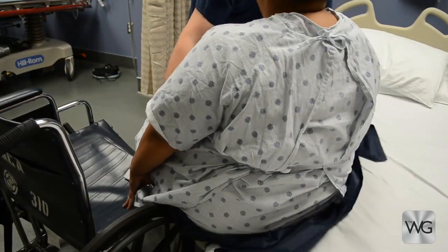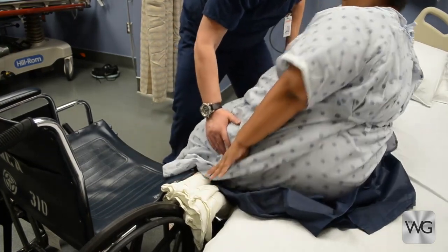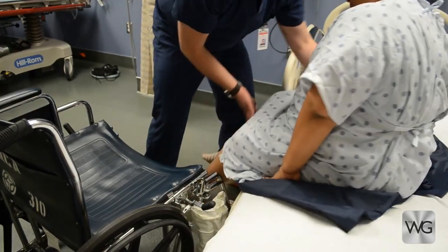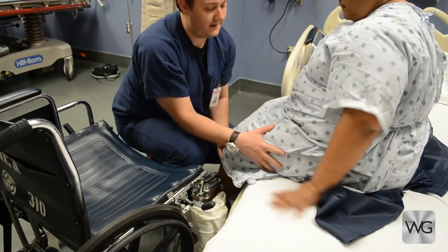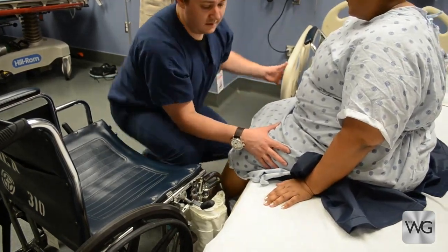The caregiver stands in front of the patient and supports the wheelchair with one hand, while guiding the patient near the hip and pelvis with the other. Once the patient is in the bed, the caregiver may assist the patient to scoot back onto the bed by lightly guiding the patient's hip and lower extremity on one side and then the other.